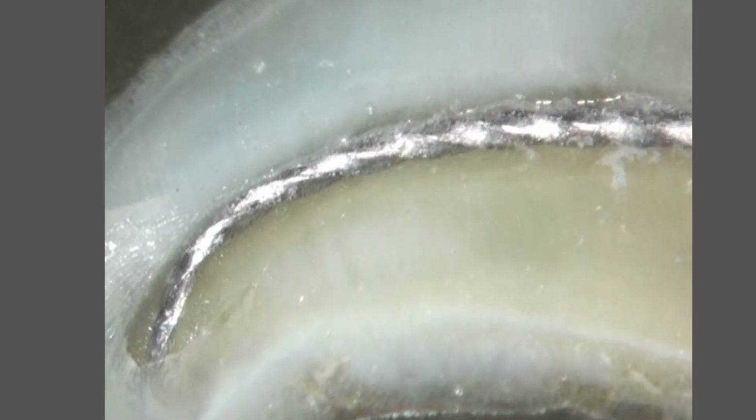So now you're trying to instrument, the rubber stopper is at 20 millimeters, but it unwound and stretched a millimeter. It spun tons of times, hundreds of times potentially inside that canal before you took it out and realized, oh, it's unwound. An unwound file that's maybe 21 millimeters to begin with now is 22 millimeters. So all of a sudden, you instrumented, let's say, a millimeter longer than what you thought. You blew open that constriction, didn't think much of it, and then wonder why now when it comes to obturation, you're getting stuff out the apex. It's because, again, you didn't quite appreciate what's happening at the apical constriction.